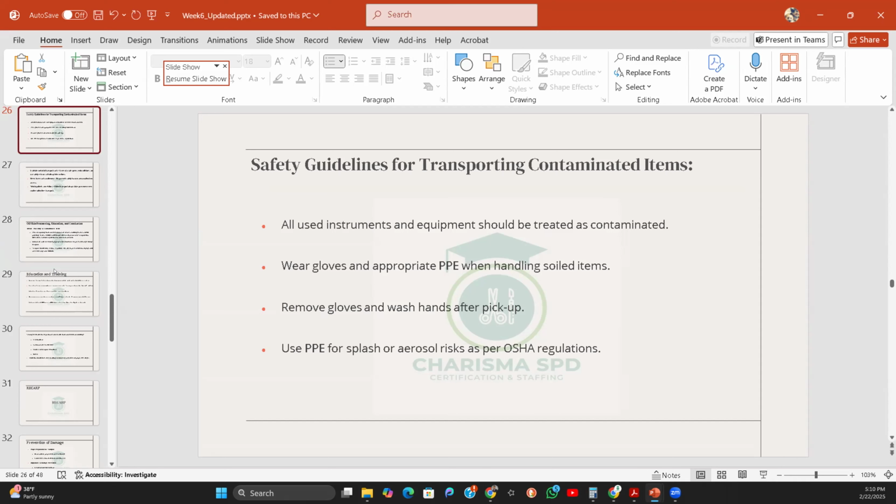Okay, so the instrument that is used on the patient, yes, it gets back into the basket. That is why we need to prep it, get it to decontamination, and wash it so that it is safe to be handled at the other side. But the instruments themselves do not come into contact with the walls of the cart that is carrying it. Does that make sense? So do we sterilize the basket too? Yeah, the basket is in a box.